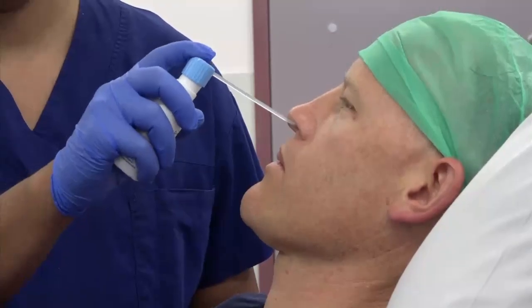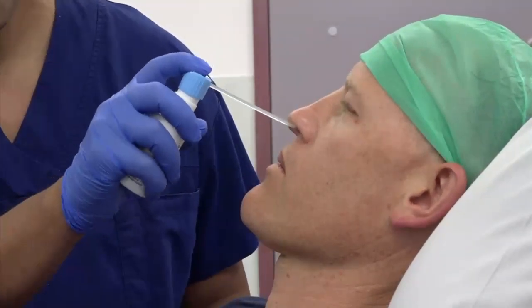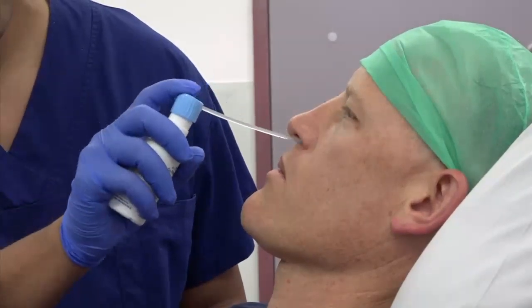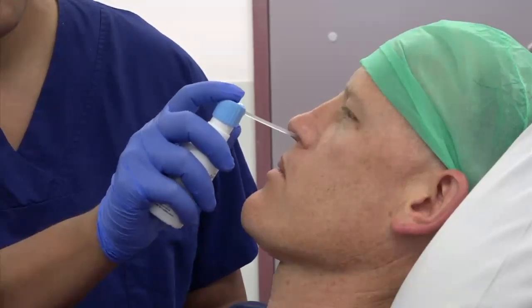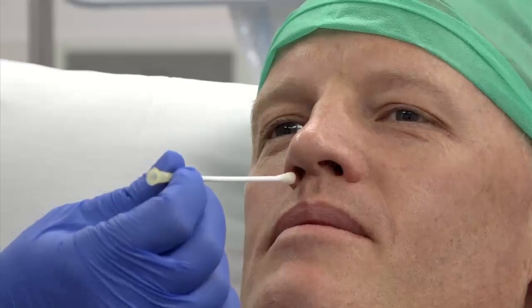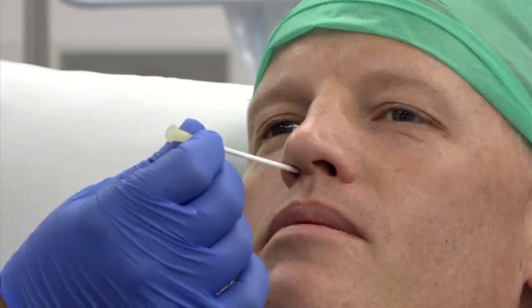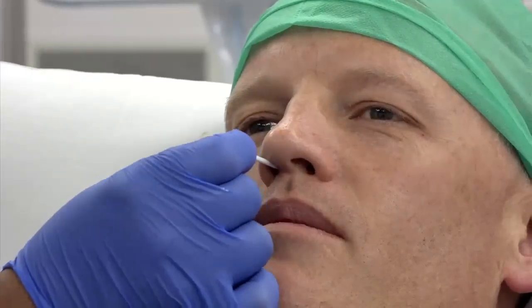Position the patient so the head is relaxed and topicalize the nose with local anaesthetic. Insert the cotton tip swabs aiming posteriorly and slightly superiorly, as the sphenopalatine ganglion lies posterior to the middle concha.